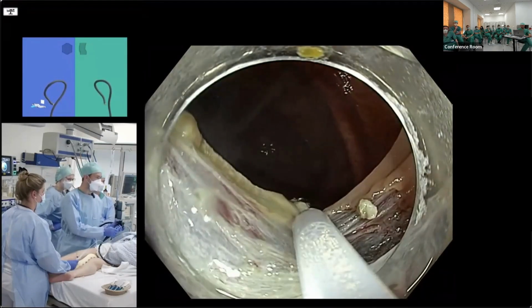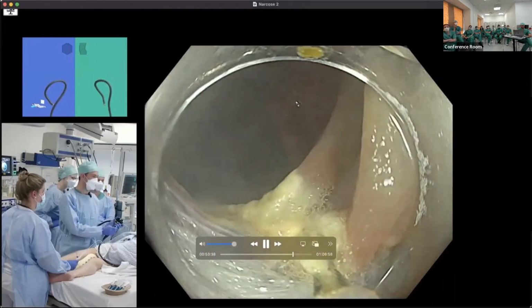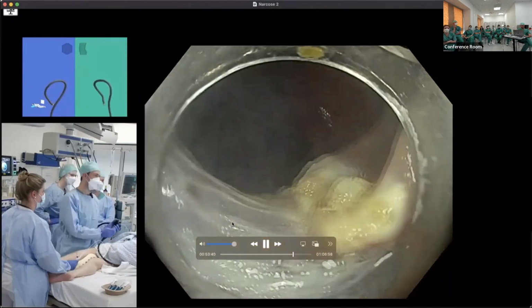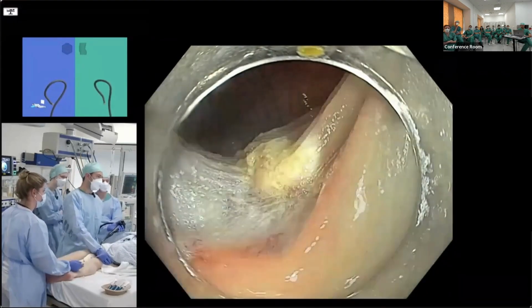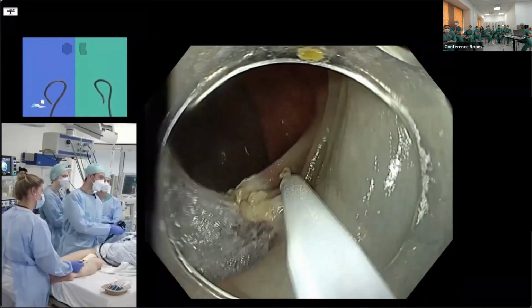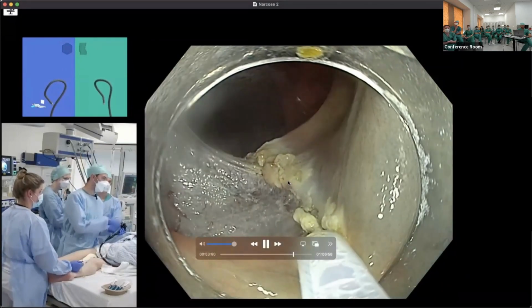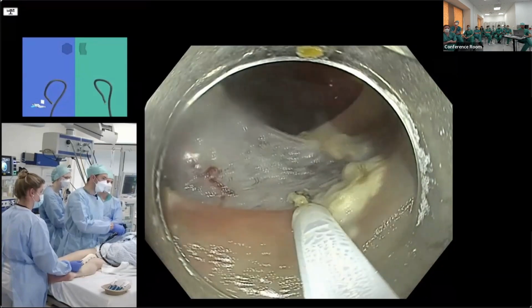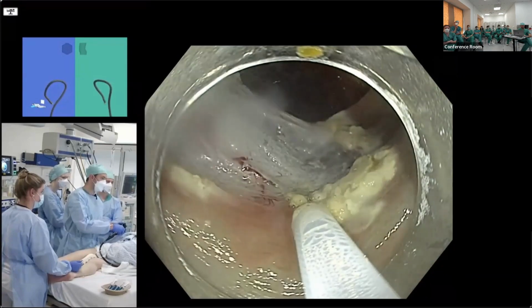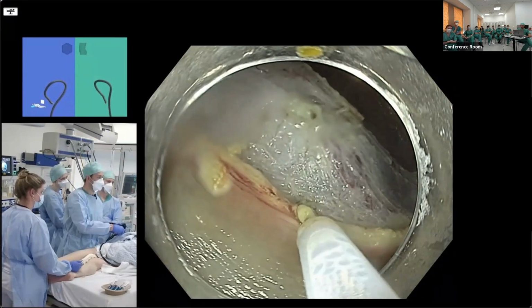And also another thing to do is, here you see me controlling the snare catheter with my hand, because the scope is actually quite stable. Sorry, Xander, but this position wasn't so bad for your polypectomy, even though it was beautiful. And so it means that you can take your hand off the scope. But as soon as you have to then go underneath, then it's more difficult to do that. Or if you're in a difficult position, you have to have that stable. But I thought your tip control was very nice.